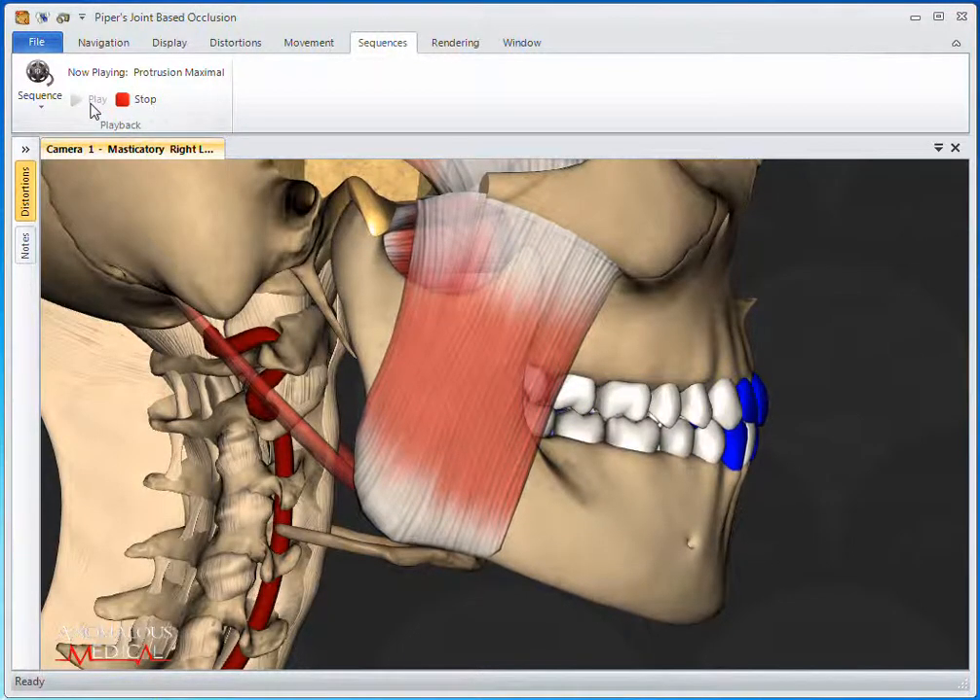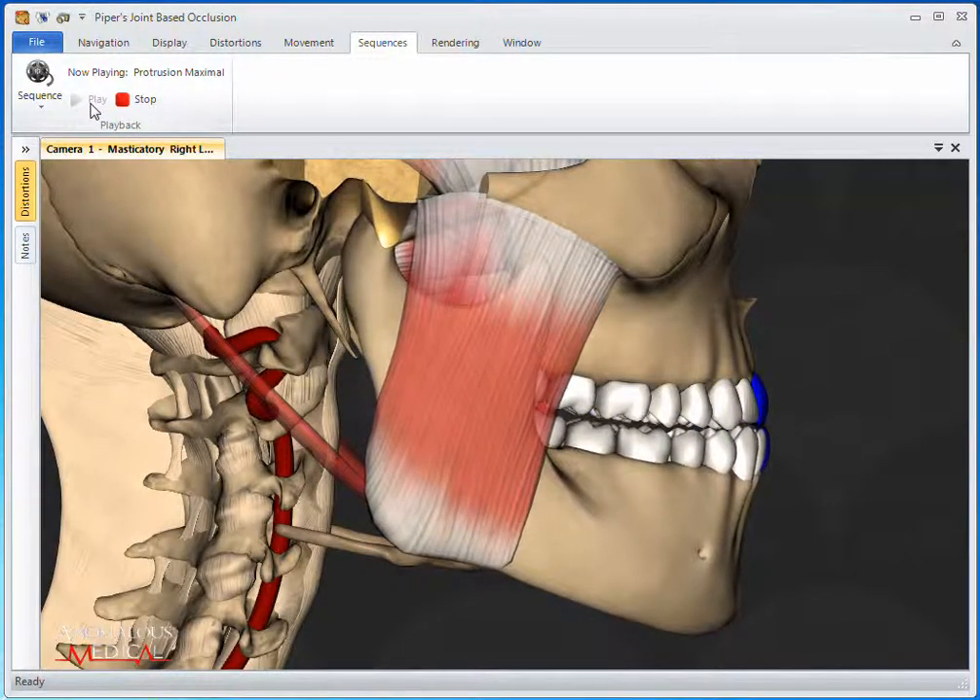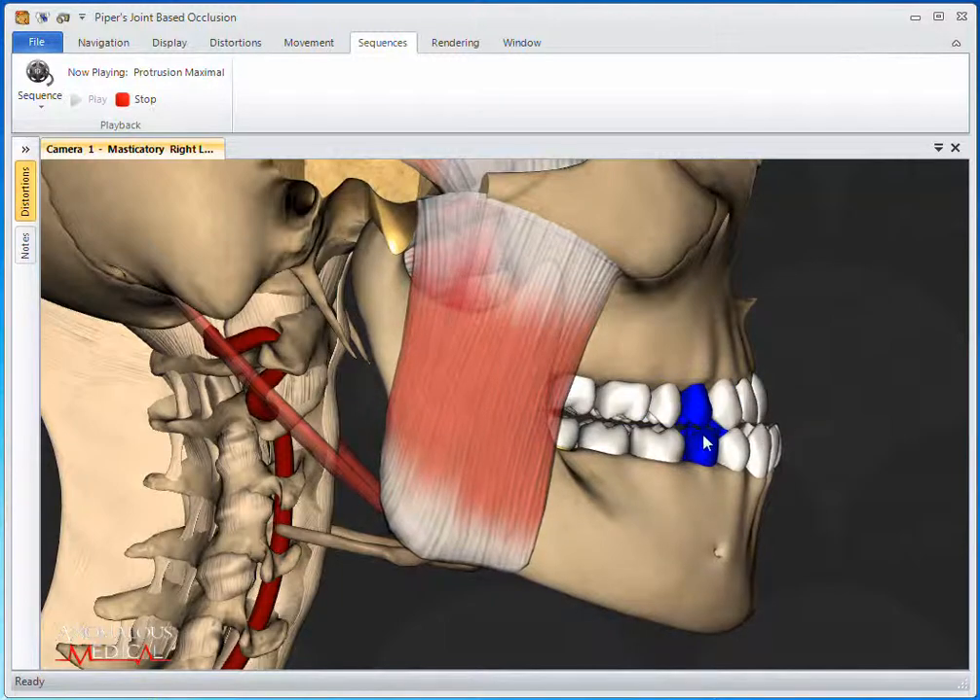The Protrusion Maximal sequence will show how the teeth come apart to guide in the front properly with normal discs.